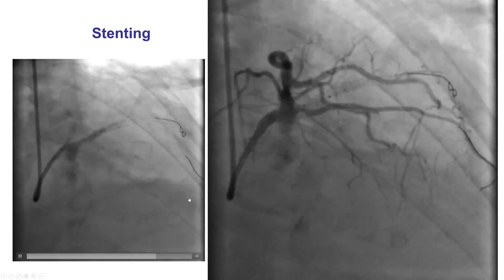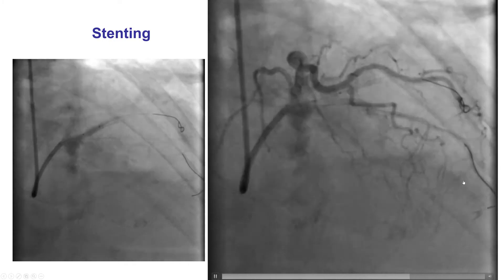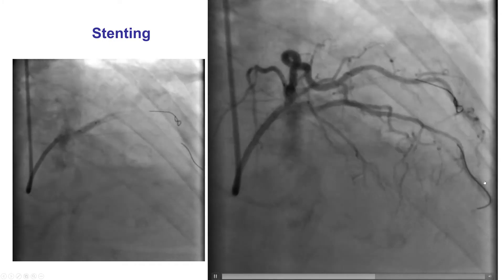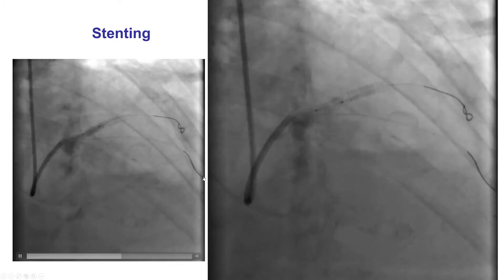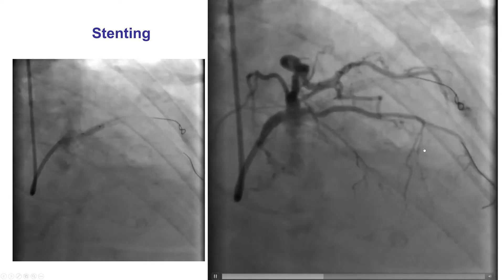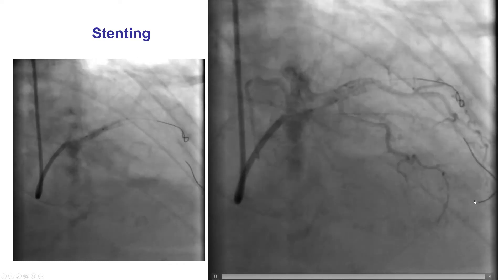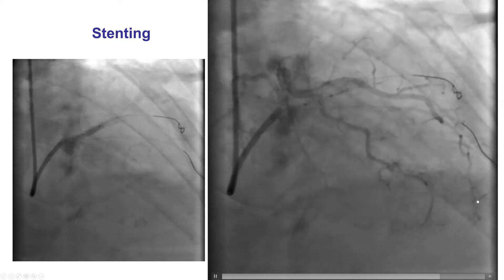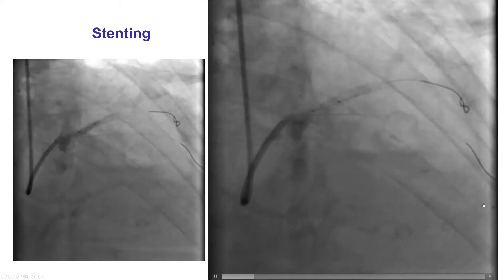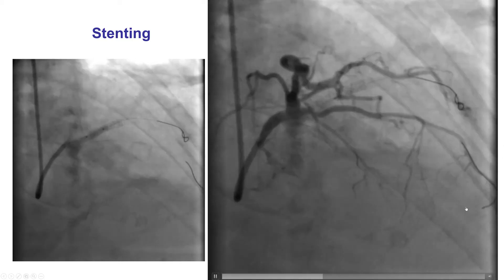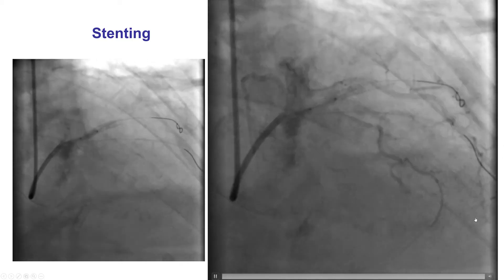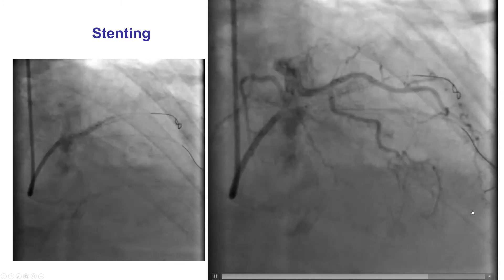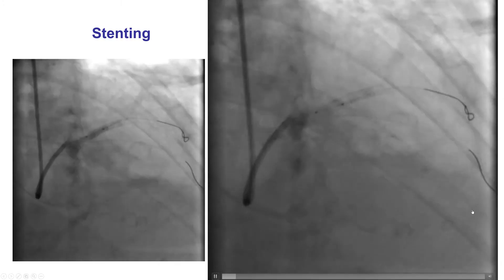It is important to pay attention to the course of this guide wire. This is a workhorse guide wire. The distal tip did go into a septal branch. Already from this view, you can see that the wire has gone into the septal branch and there appears to be some sort of extravasation or staining distal to that septal branch.